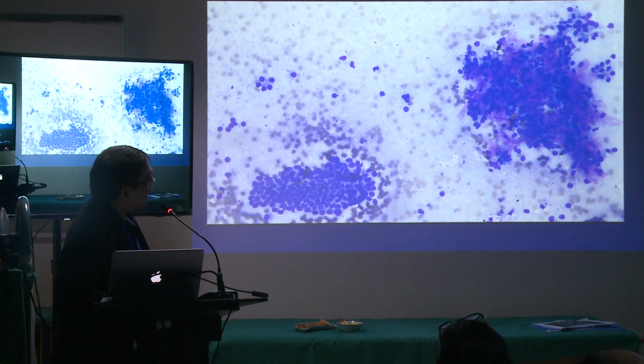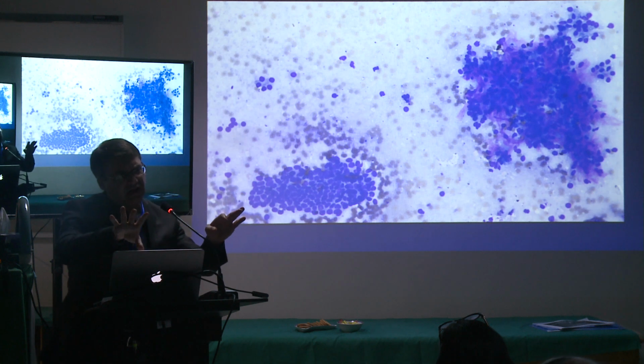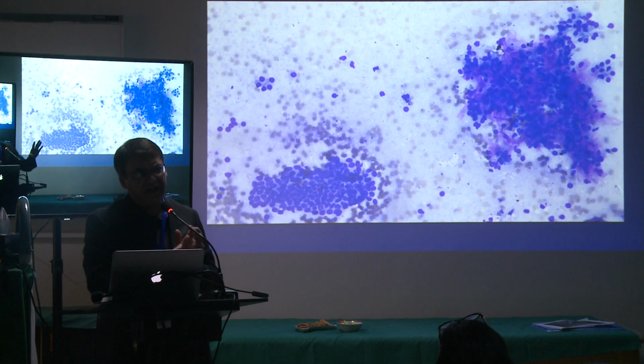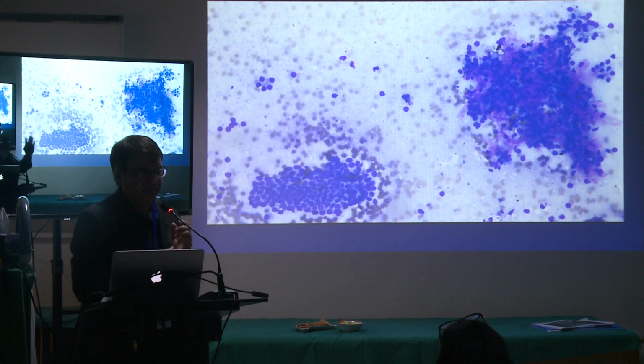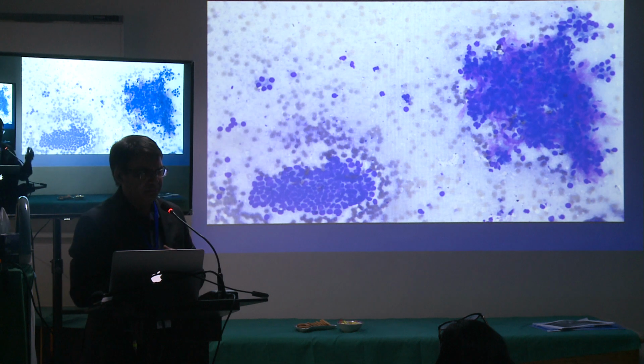But when you see this hypoechoic area, even though FNA showed it's benign, these are the patients I don't feel really comfortable letting go. These ones I keep a close eye on, especially in this case, because it looked like there was some solid tissue around that cystic area, even though the FNA really showed chronic pancreatitis, nothing major. Okay.